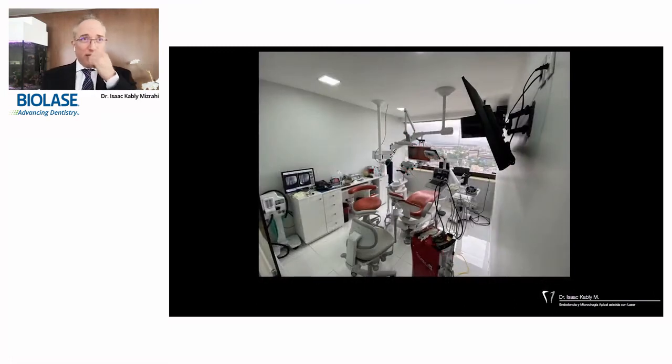So this is me. This is one of my treatment rooms where patients are seen every day. We have two lasers. This is the bomb combination, the erbium chromium YSGG laser with a 940 nanometer laser. We have some dynamic navigation, some 3D microscopes. Sometimes we use some gas for patients to be comfortable. And we treat patients every day.